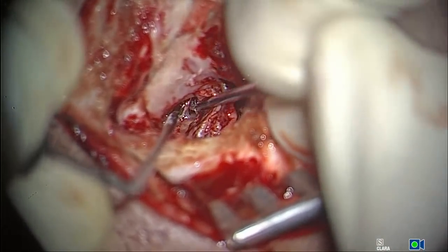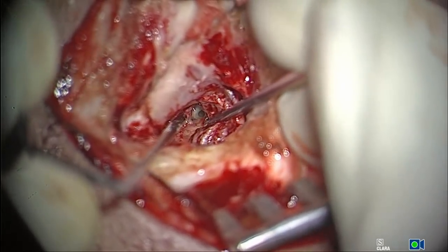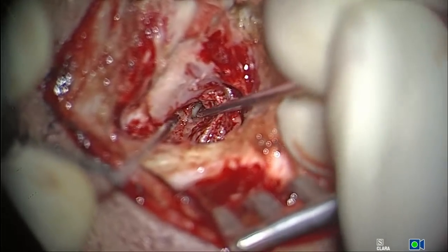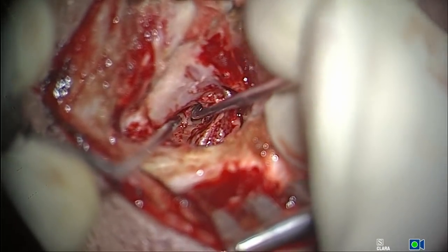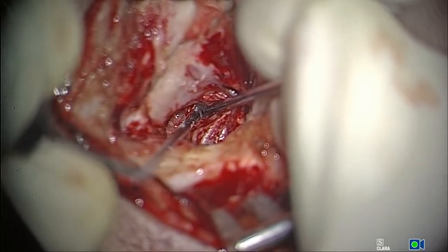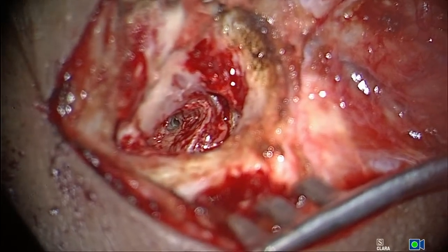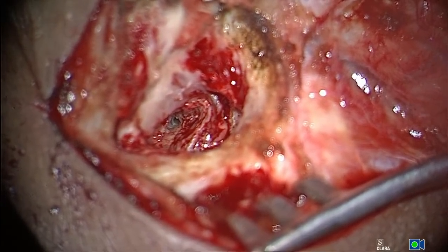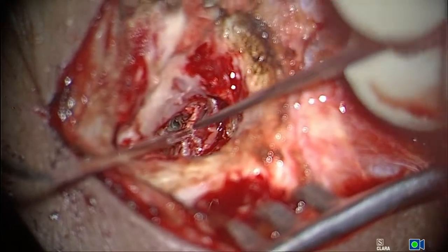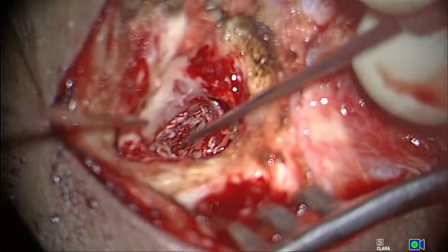So that's the eustachian tube. You can see that very beautifully, the eustachian tube. See how the mucosa is looking. I'm not traumatizing anything there. Everything is done very, very gently. Can you see the eustachian tube? I can in fact see almost, wow, see that? Can you see that or not? Such a beautiful view. Honestly speaking, I really don't believe in all that endoscope stuff.